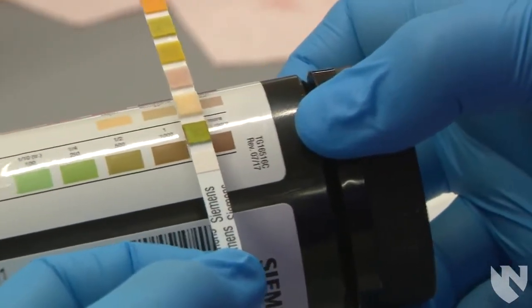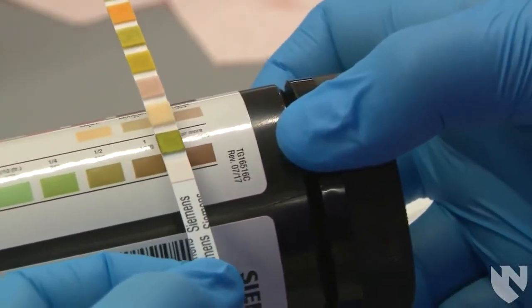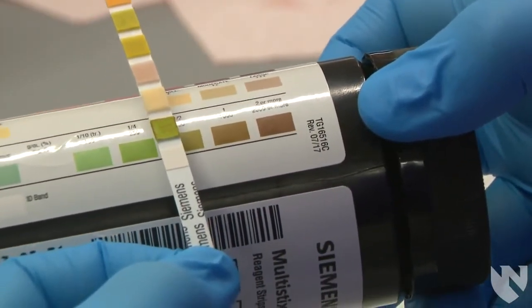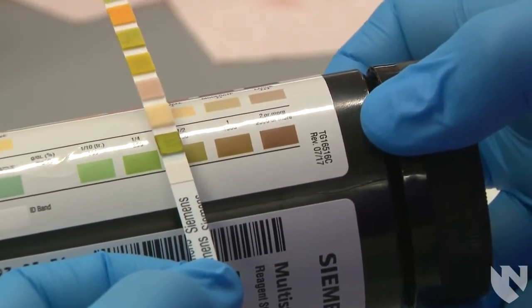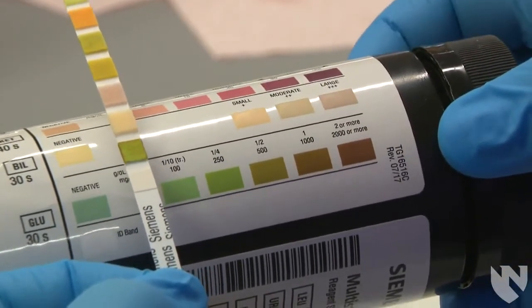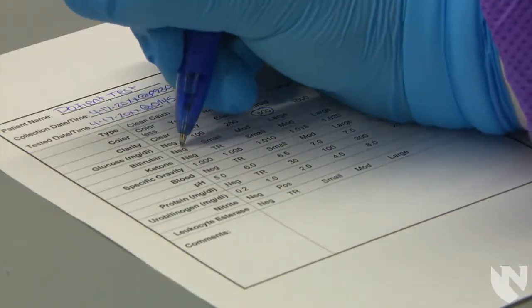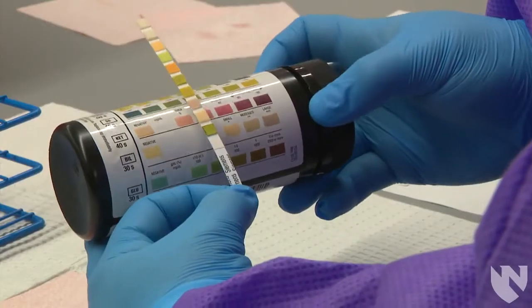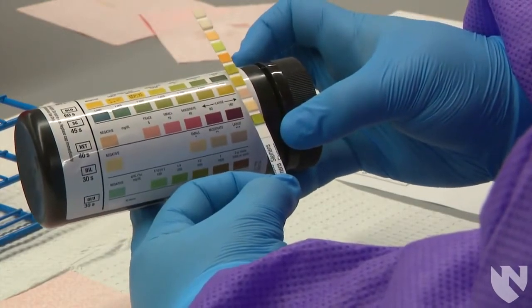When your timer reaches 30 seconds, move the reagent strip from one side of the canister to the other on the glucose line until you find the color on the canister that matches the color on the reagent pad. The glucose value is 500. Do the same for the bilirubin line. The amount of bilirubin here is negative, and record your answers on the worksheet. Roll the canister in your hand to ensure the line you are reading is the line facing you.